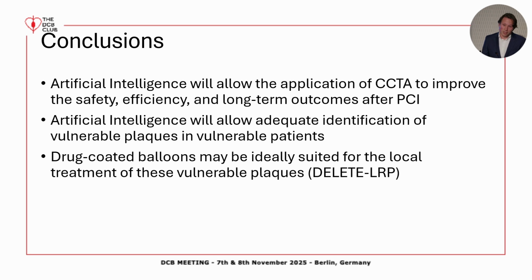So to conclude, artificial intelligence will allow the application of CCTA to improve the safety, efficiency, and long-term outcomes after PCI. And CCTA may also be a very interesting way to follow up our patients who have had DCB, and maybe also even those patients who have dissections, particularly when the resolution of the CT is high enough, as with the photon counting CTs that we'll be seeing more and more in our clinical practice.